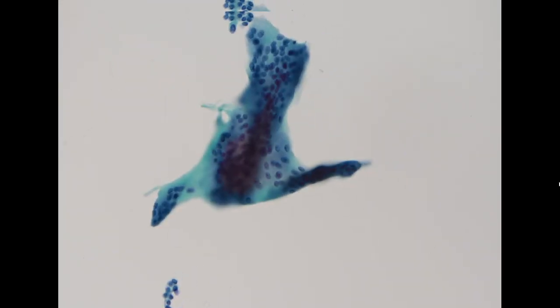I just want to show you the feature of a multinucleated giant cell. So this is a multinucleated giant cell. Giant cells are very frequently seen in PTC, but remember they can also be present in the setting of thyroiditis. So this is a multinucleated giant cell. These are PTC cells. And this is a multinucleated giant cell as well. So the case is diagnostic for papillary thyroid carcinoma.